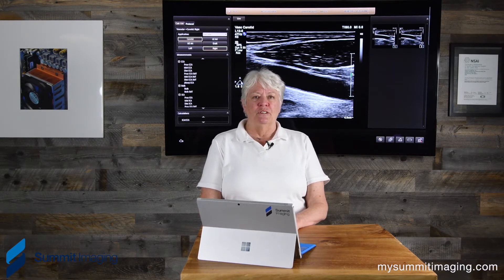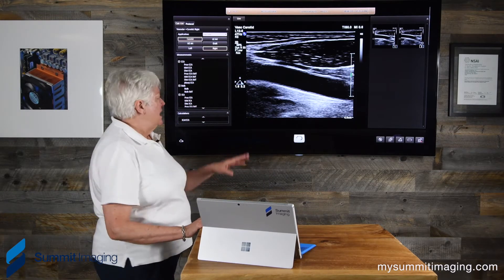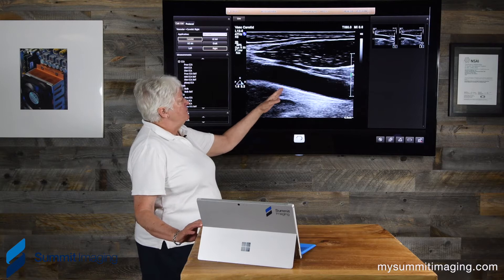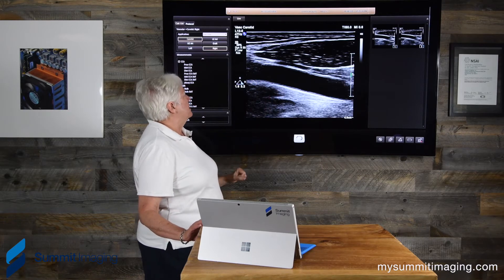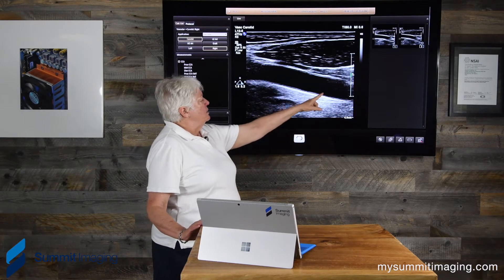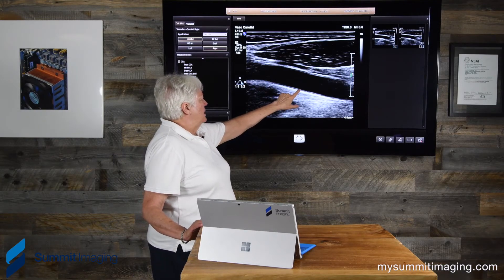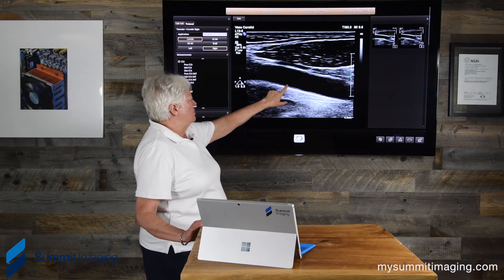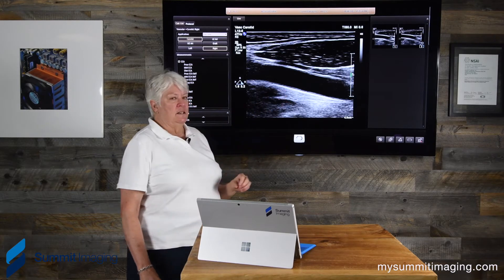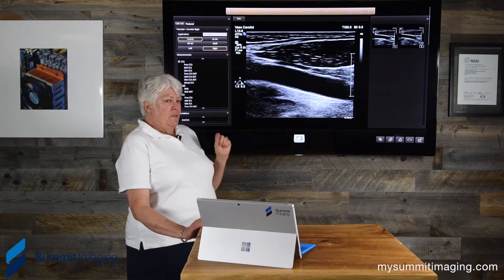We're going to start with this image. This happens to be the carotid artery and we're using a Philips Epic system with a linear transducer, the L12-5. This is the head of the patient and the feet; this is the common carotid artery in its length. The important thing about this image is what we can see right here — this is the wall of the carotid artery — and it's important that the transducer give us the resolution we need to measure that thickness, which is very important diagnostic criteria for carotid artery disease.